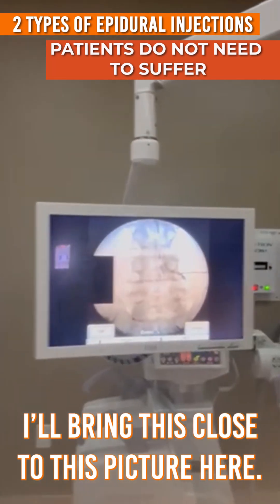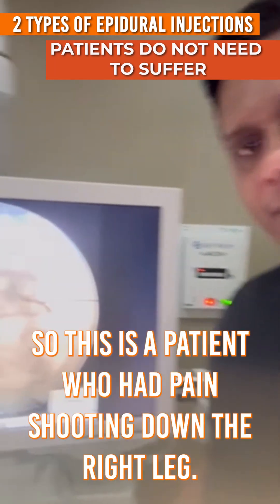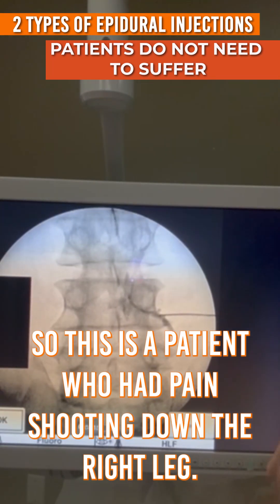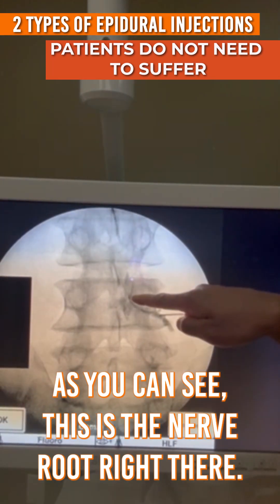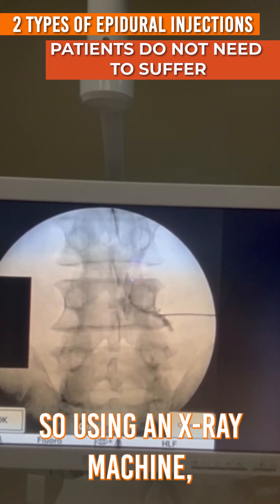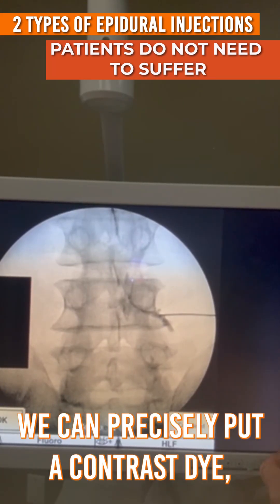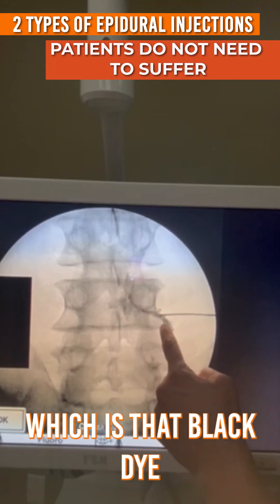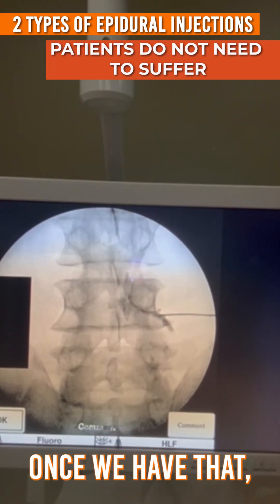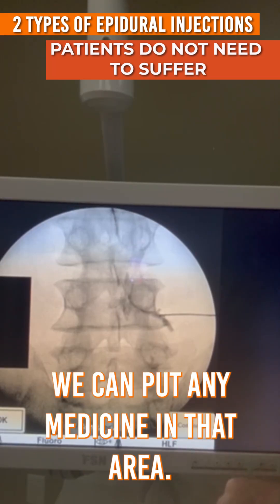This is a patient who had pain shooting down the right leg. As you can see, this is the nerve root right there, and this is my needle. Using an x-ray machine, we can precisely put our contrast dye — that black dye — at the L4 nerve. Once we have that, we can put any medicine in that area.